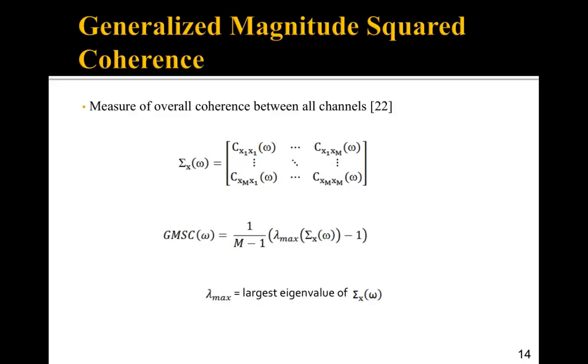One of the issues you have with EEG data when you have like 128 channels or even 32 channels, you generate many, many, many numbers. And for those of you who are familiar with clustering and pattern recognition algorithms, you know that you have all these numbers and you have to pick which one is the best at classifying group A and group B. The more numbers you have, the more you tend to do what is called overfit or overspecify the problem.